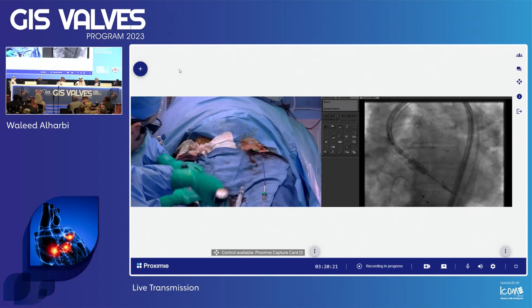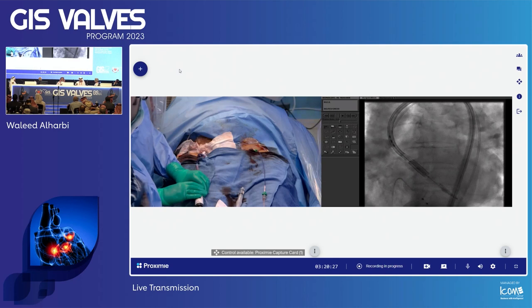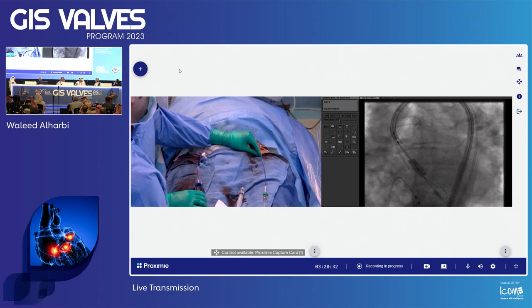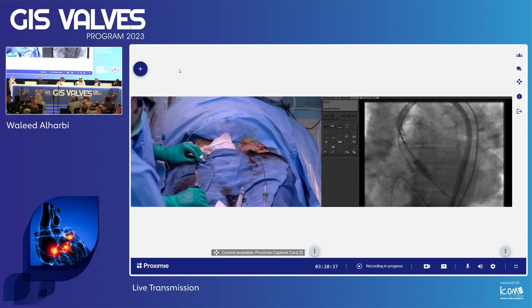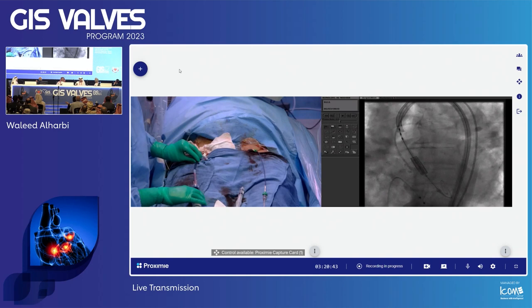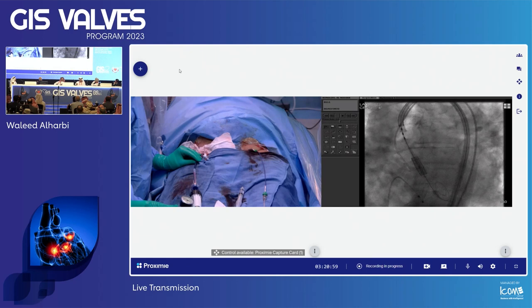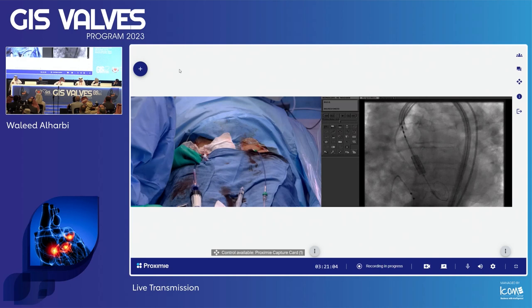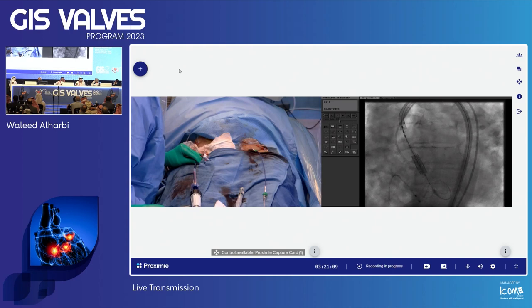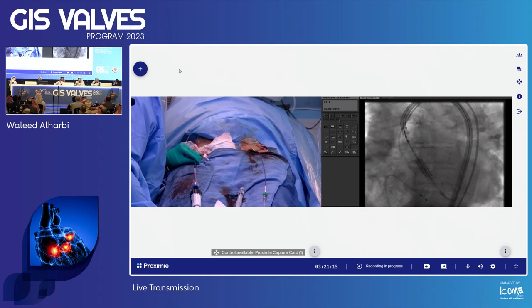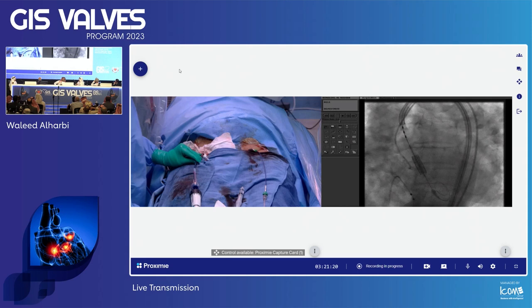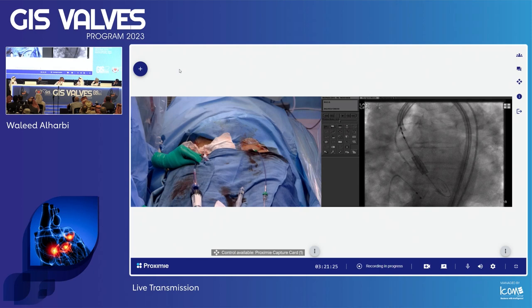Proceeding with positioning. Waleed — are you going with 50-50 or 80-20 deployment depth? Because the calcium burden is low on CT, I don't want to go to 90-10, so I'll try 80-20. Our goal is the inferior border of the middle marker, though the balloon is slightly off-center. We're going to do a test pacing at 180. Make sure it's stable — give it a small correction and check pacing capture.